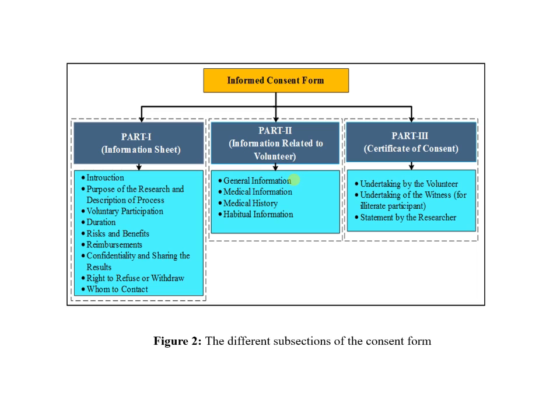So what does the information sheet contain? It contains the introduction of your experimental process. I'm just telling the consent form from a research perspective, not from a clinical perspective. So while you are taking an ECG for research purposes, this information must be there in your consent form, and it is based on the WHO guidelines that involve animal or human study.